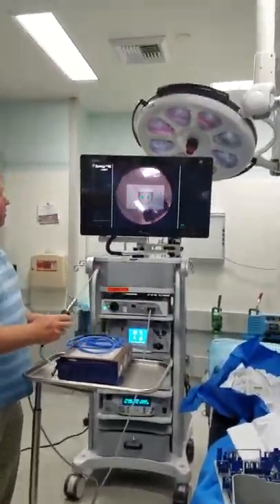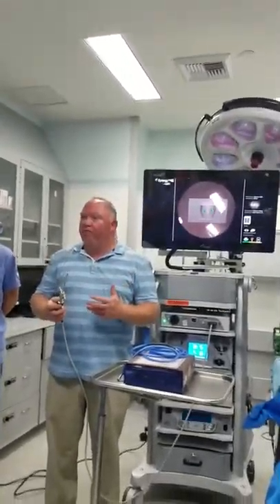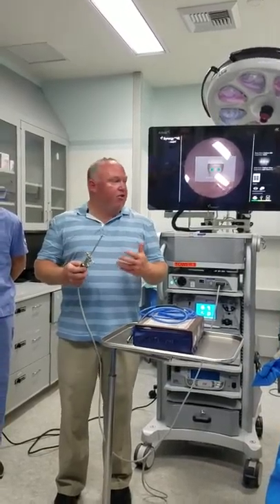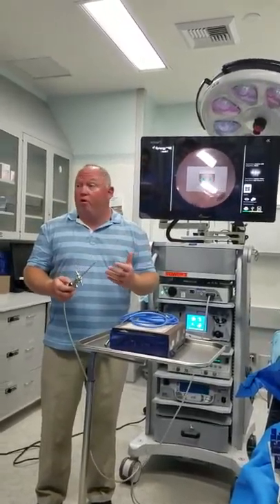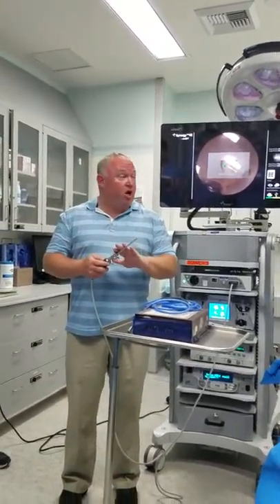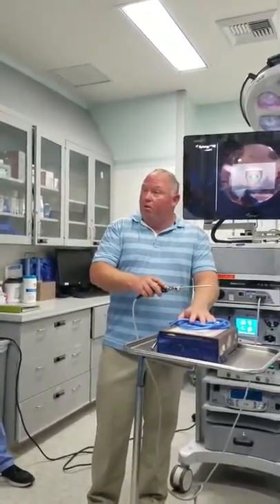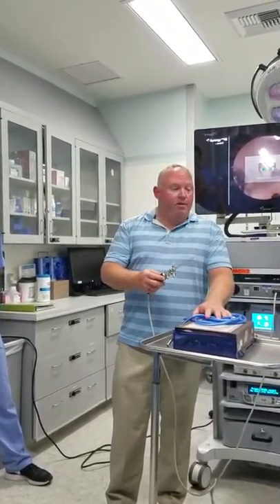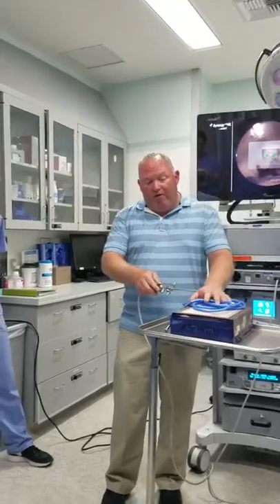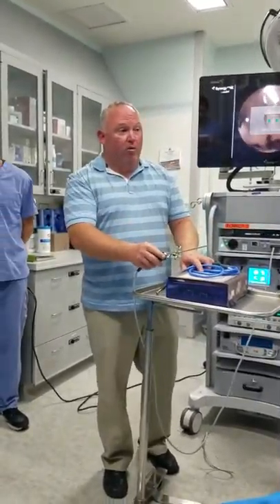Okay, so I have a camera now. But I need light. I need something bright, like a flash, right? But I can't just have a flash every once in a while, I need it all the time. So it gets very, very hot. You have that cold fluid going over it, which keeps the scope cool. But you have to be careful, if you have the light cord in here, you cannot leave it on the patient's body or the Mayo stand, it will burn a hole through. I've seen it, it'll burn a hole right through the drape. It's that hot, okay? So we'll be using it, it'll get kind of warm. But we have a very big area here, so it won't be too hot, it won't burn anything. But you have to be careful when you're putting it down.